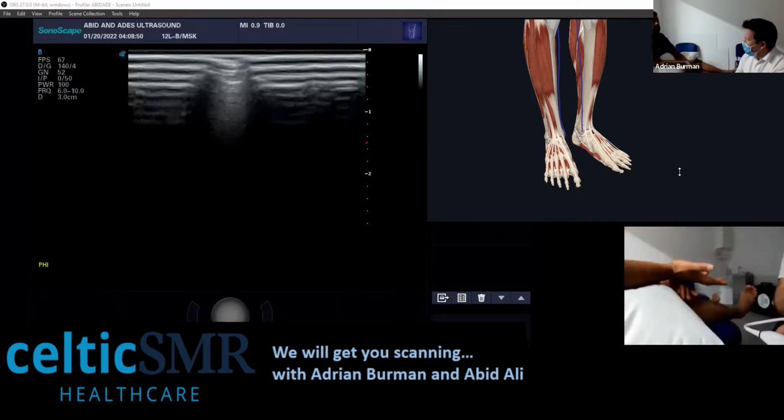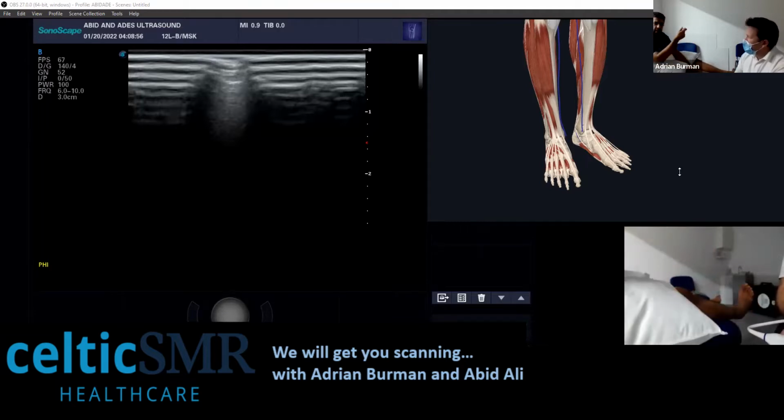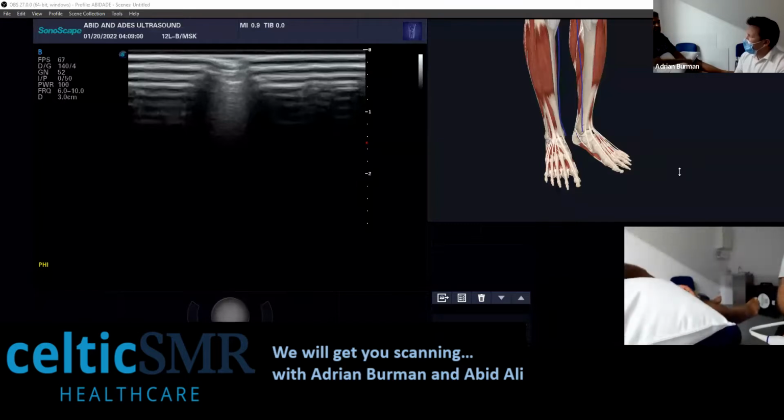Another example might be the heel, perhaps. Yeah, we often flag the gain up when we're looking at the plantar fascia. Yeah, because you've got to penetrate through the uppermost layers of this kind of thickened skin tissue, or subcutaneous fat. Then if you're looking below that layer, you need to work with the gain. And don't be stuck on just that. Turn it up, turn it down, play around with your settings.